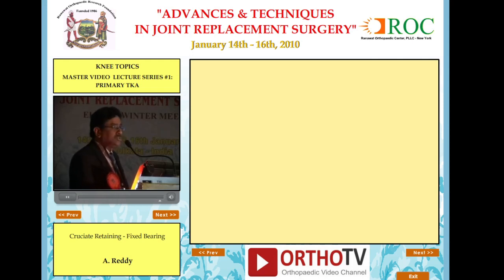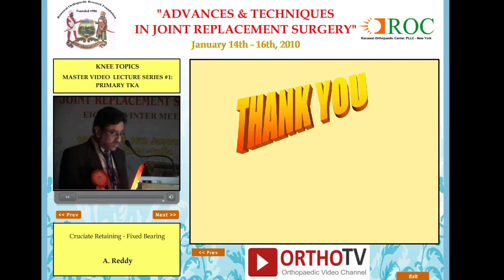In summary, cruciate retaining is as good as the posterior stabilizing knee, as far as the technique is concerned. Number 2, there are some surgical steps which are to be taken care of. Number 3, you need not be dogmatic that cruciate has to be retained. If you are in doubt, you can take it off. Number 4, if the cruciate is tight, you can do the balancing on the femoral side. And those are the 4 important points. With that, cruciate retaining can serve you as good as the posterior stabilizing knee.